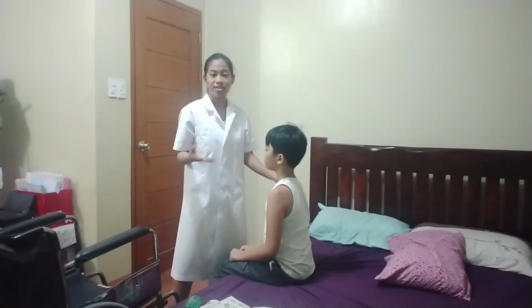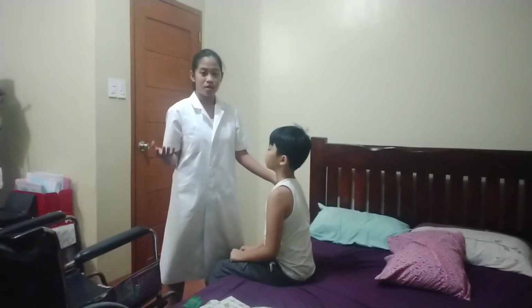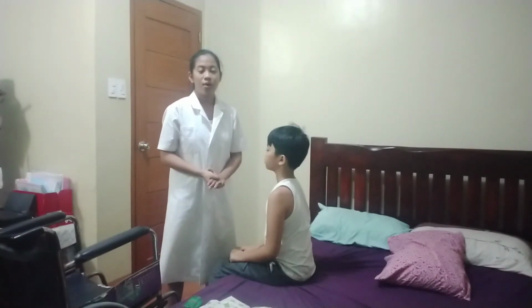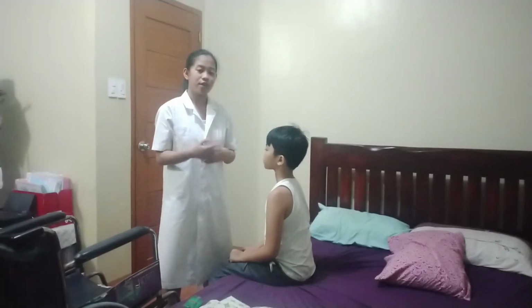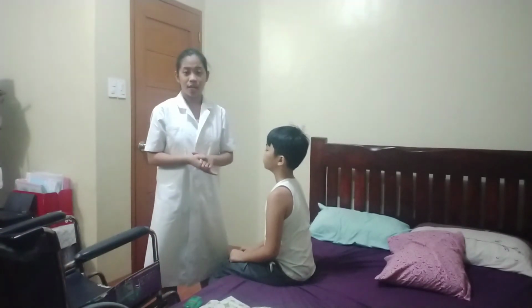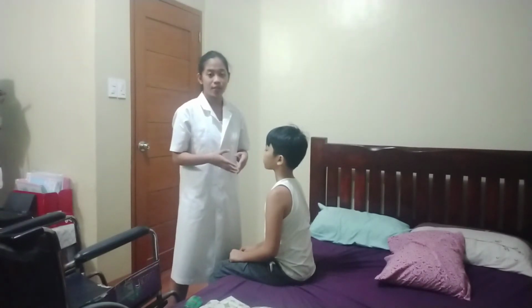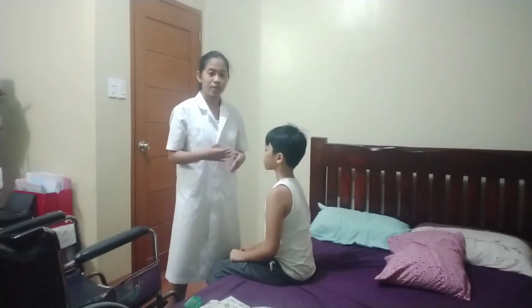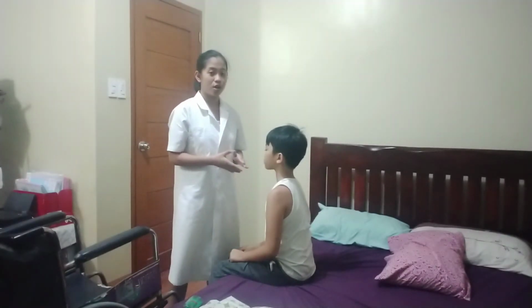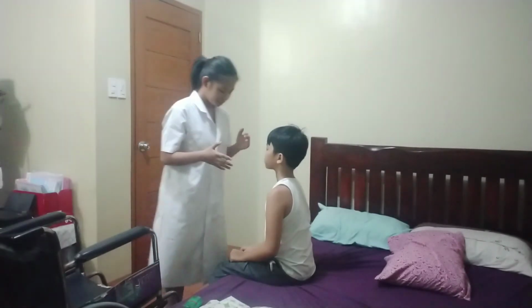So if I have an assistant nurse, I will have my assistant assume a similar position. And then I will encourage my patient to make use of a stand assist device if it is available. And if it is necessary, I will have the assistant nurse grasp the gait belt on the opposite side, and then I will use the gait belt to assist the patient to stand up. So I will rock back and forth.